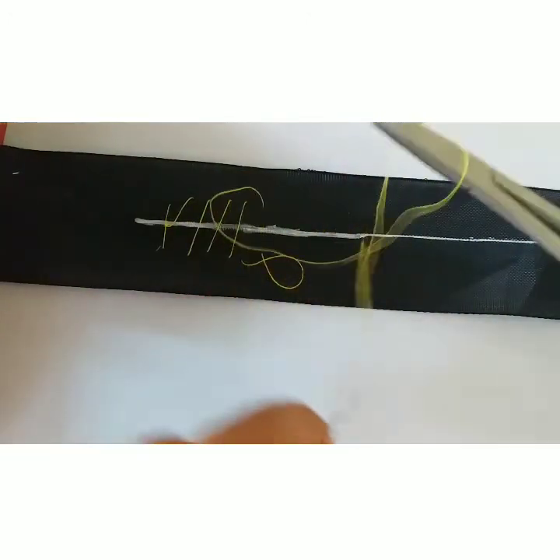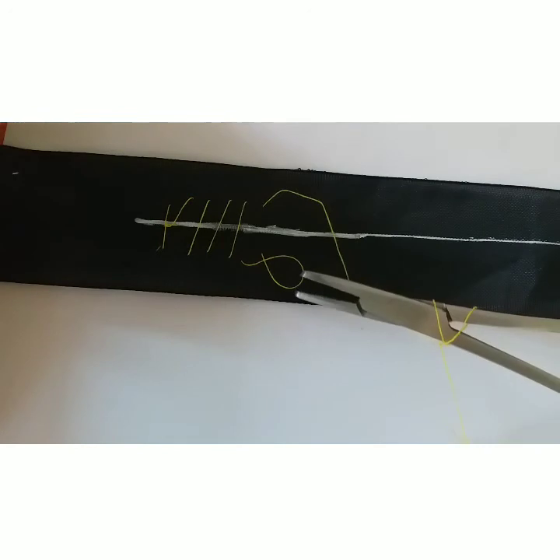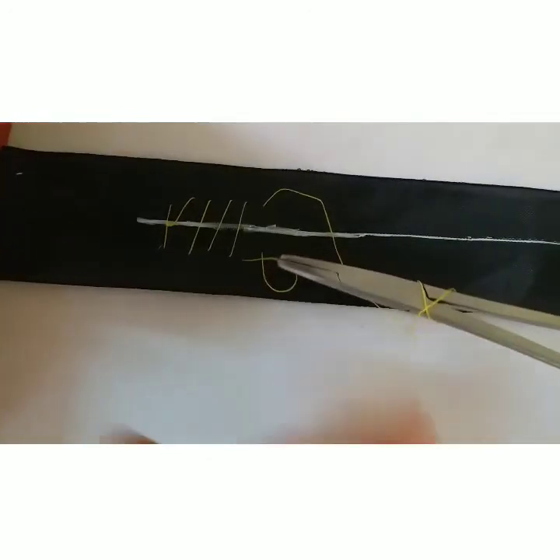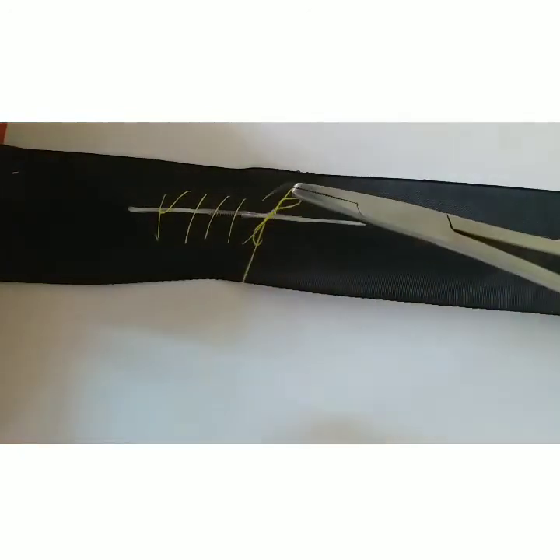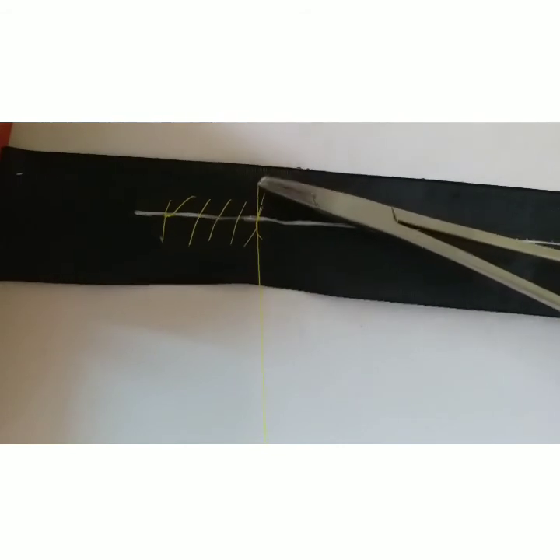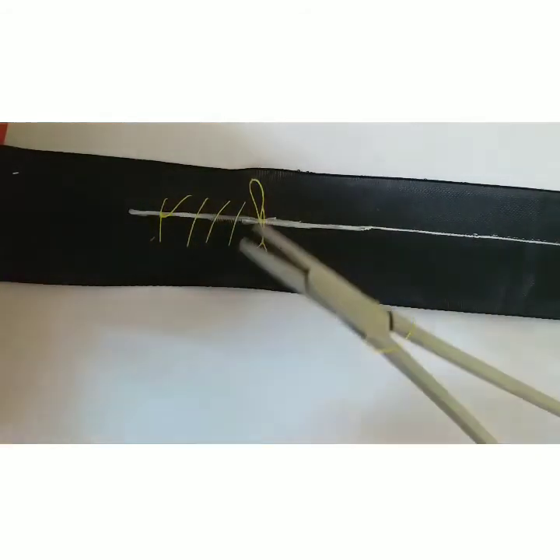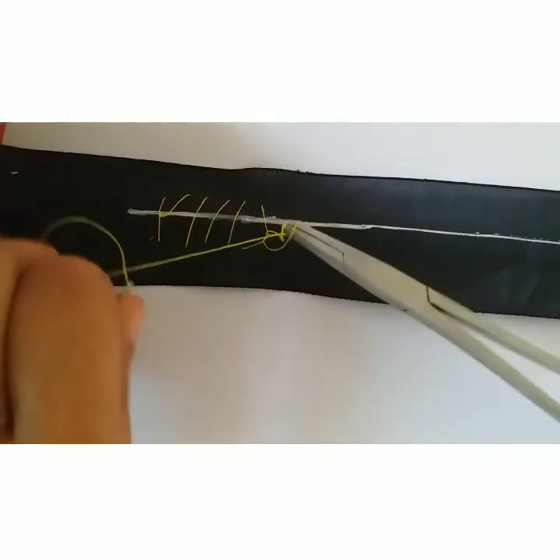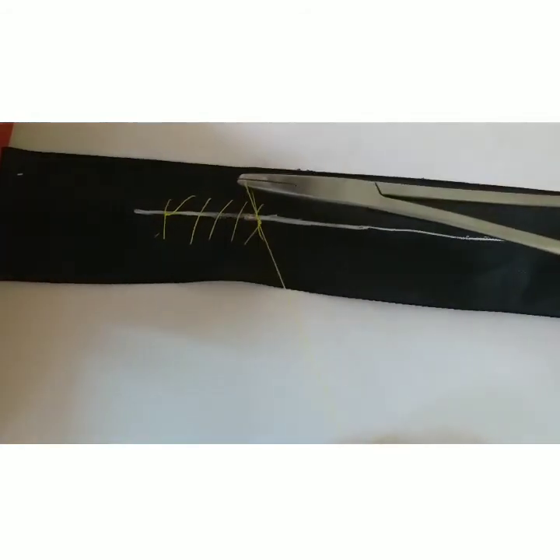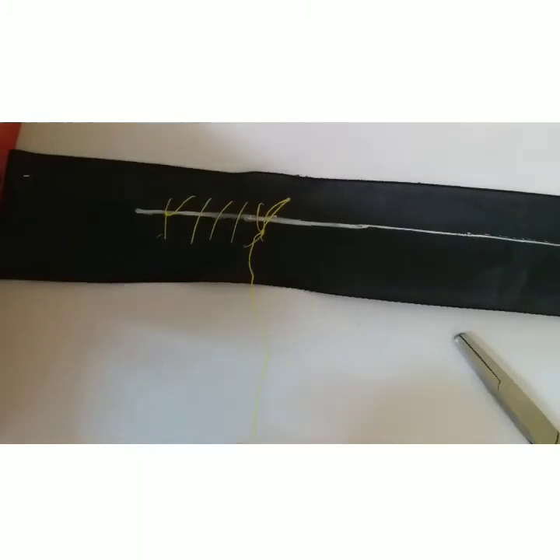The two methods are correct, but one gives better closure in the suture. Then we cut the extra material.